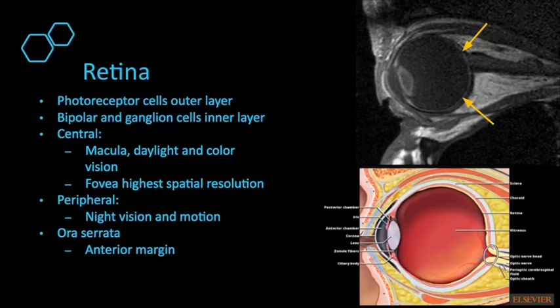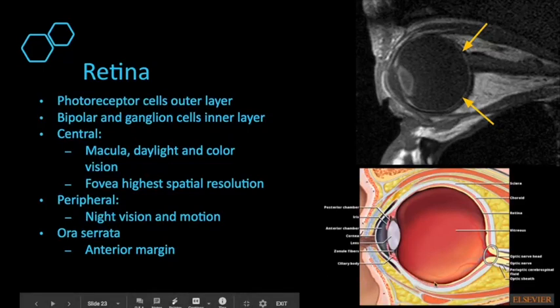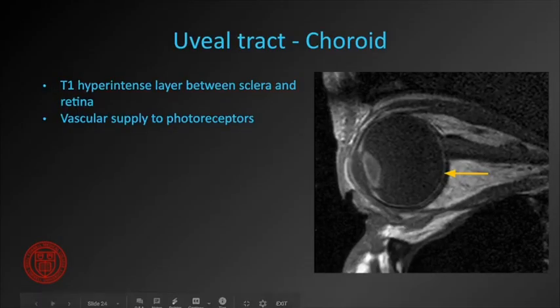The retina is where our photoreceptor cells lie, along with bipolar and ganglion cells that transmit input back toward the optic nerve. Centrally we have the macula for daylight and color vision — that's where our cones are. Peripherally we have the rods. The anterior margin of the retina is called the ora serrata. The middle layer of the globe — between the retina (inner layer) and sclera (outer layer) — is the uveal tract, a pigmented tract that is T1 hyperintense, making it easy to identify on high-resolution T1-weighted images.